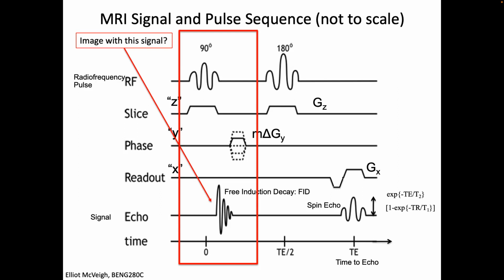And then we get all that done, like with scout images. I'm getting everything right, and, okay, great, let's do it. We're going to shoot this echoplanar image, which is when these gradients are oscillating at ridiculously high rates, so that we get data out very fast. And it makes a high-frequency pitch noise, like beep, when it's doing it.